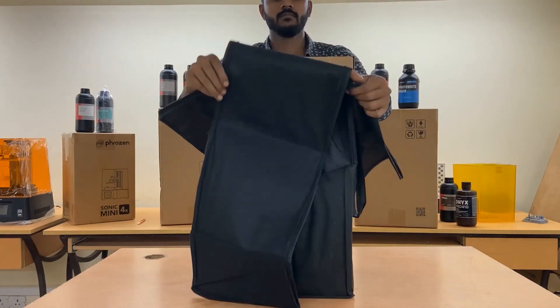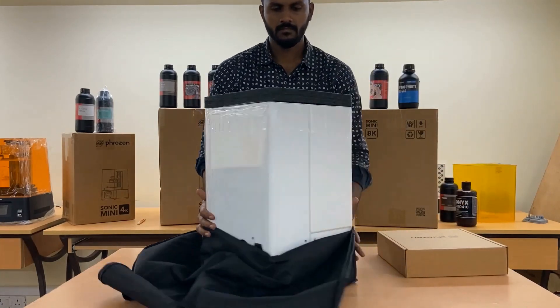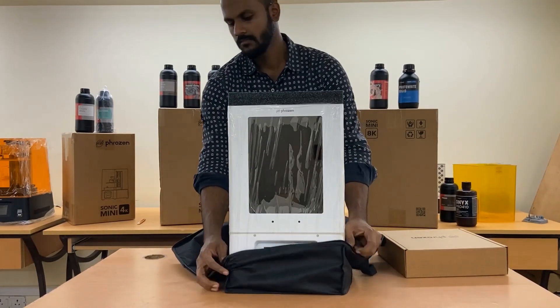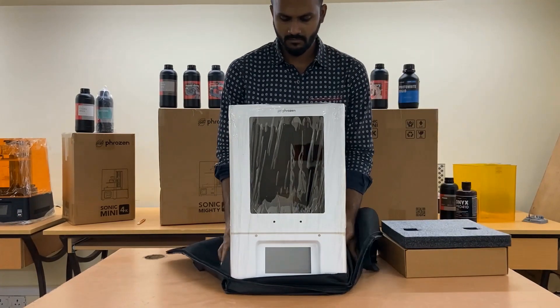Used for various dental applications like digital dentures, ortho models, models with removable dies, indirect bonding trays, surgical guides, bridge wax-ups, and bite splints.